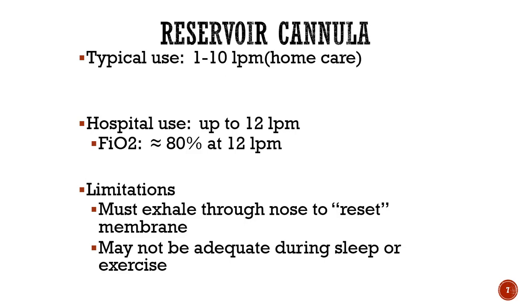So sometimes that can be an issue, but I really don't want you to focus too much on those, because when you think about the typical activity level of somebody with COPD, if they're walking, they're getting very short of breath, and oximizers are standard for people who are going home with oxygen needs that have COPD. So I think it's a weird limitation to have on the manufacturer label, because dyspnea with exertion is pretty common for COPDers, and these reservoir cannulas or oximizers have been successful every time that I shouldn't say every time, but have been successful for a lot of COPD patients.